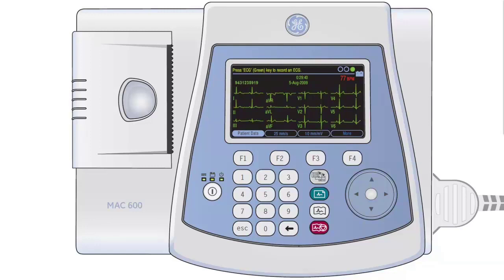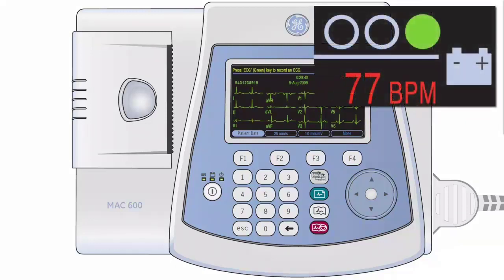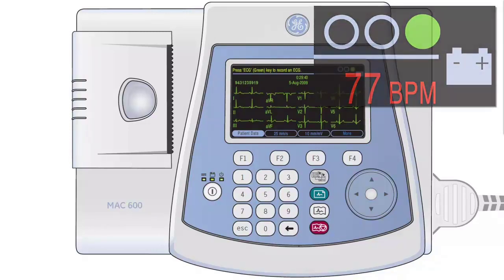The quality of the trace can also be reviewed using the trace indicator located at the top right hand corner of the screen. A green indicator means that there are no problems and the machine is ready to capture the ECG.